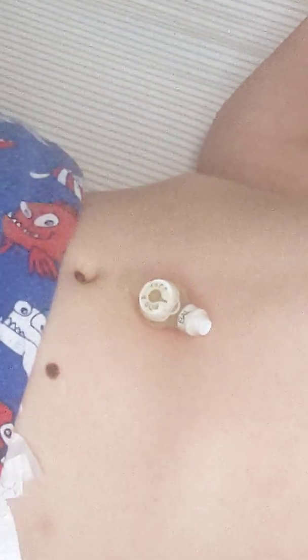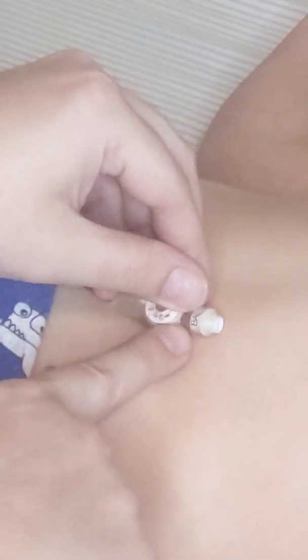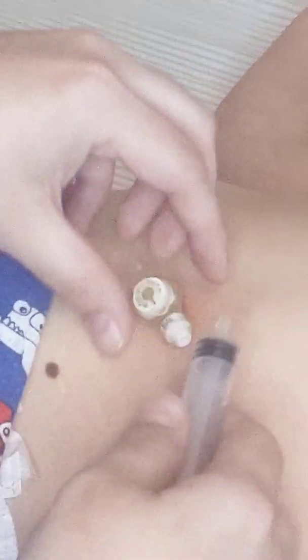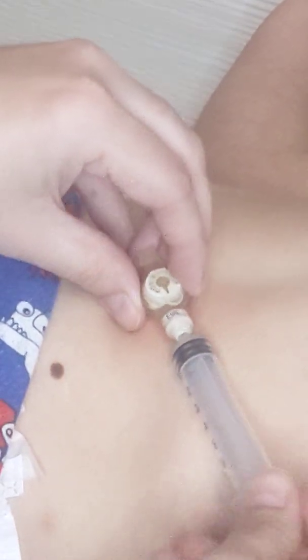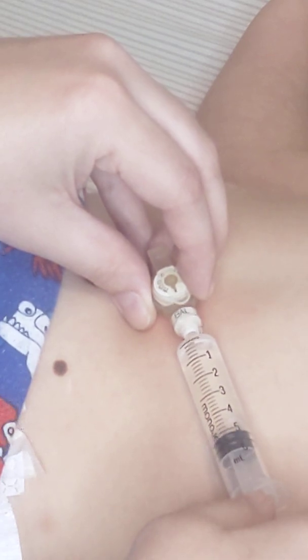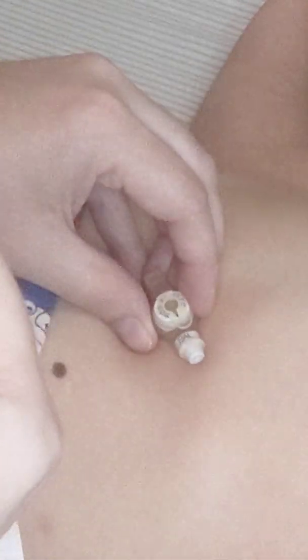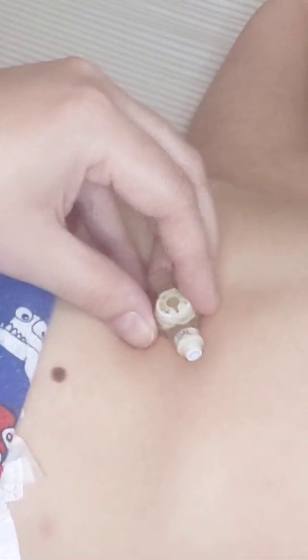Now that that's clean, I'm going to take one of the balloon syringes. You'll see a BAL marked right here. That's for the balloon, and there's a little valve in there. When you insert the syringe in there, it opens the valve, and then it allows you to extract the water from the balloon that's holding it in. As you can see, there's about 5 ml in there right now, and that's pretty normal. I usually put 6. Sometimes there's some water loss. So now we're going to get ready to pull this out.